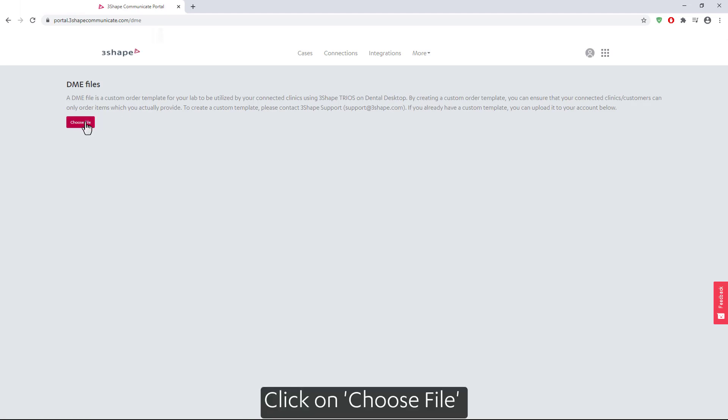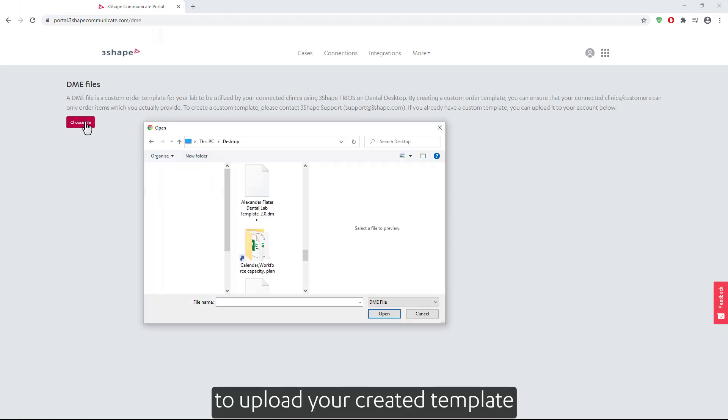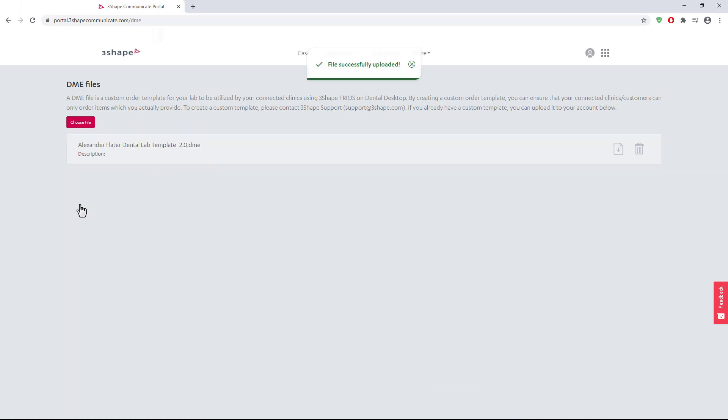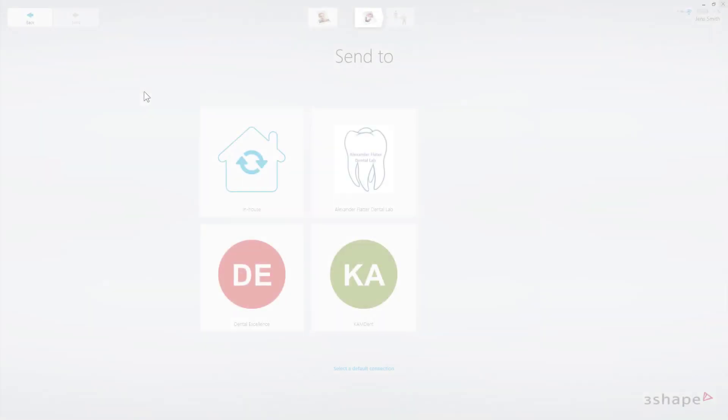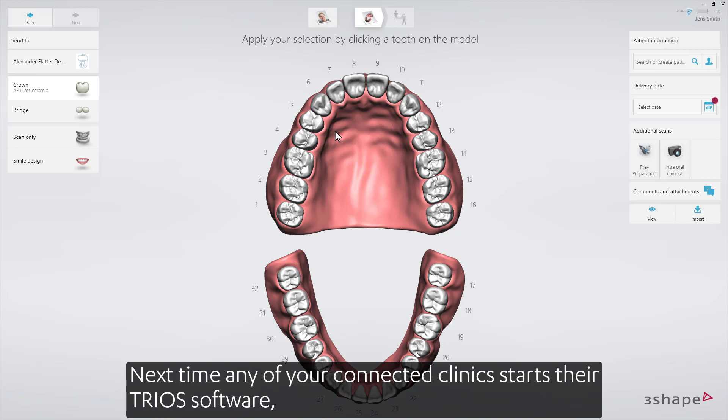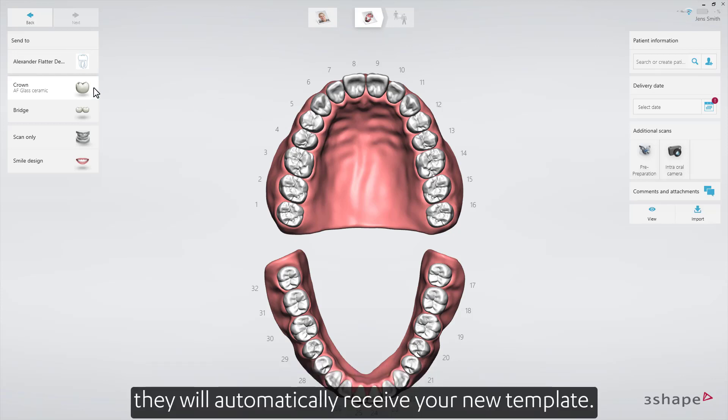Click on Choose File to upload your created template. Next time any of your connected clinics start their TRIOS software, they will automatically receive your new template.